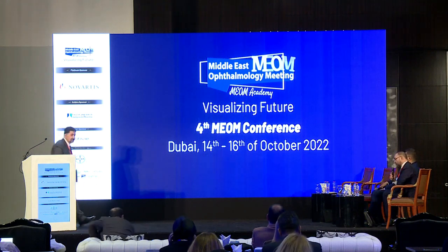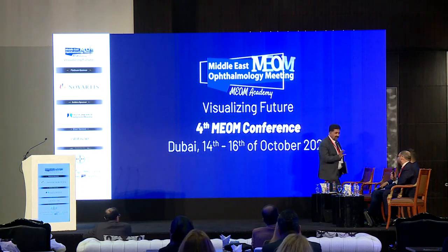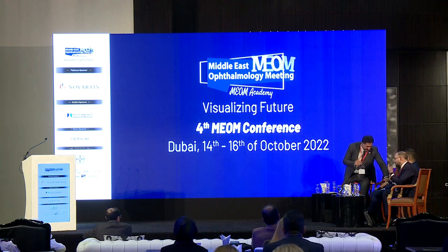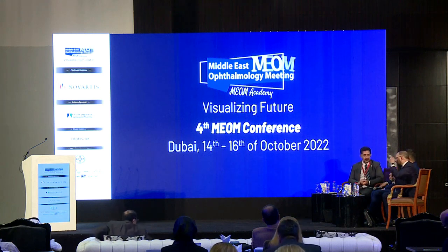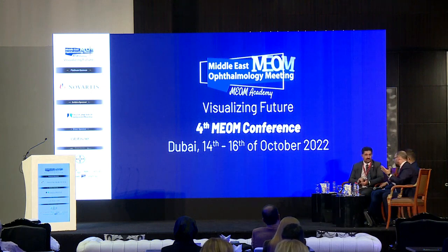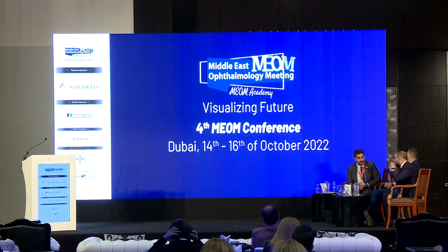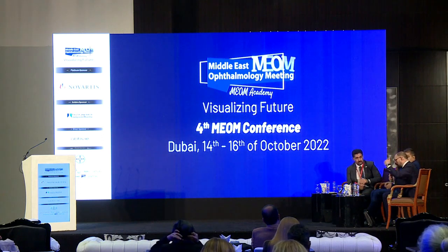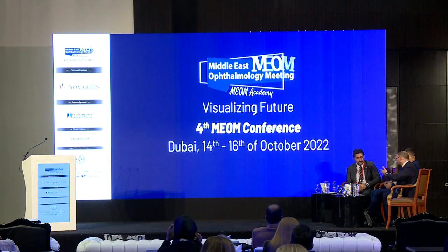Thank you so much. Now we all know that this formula is working, but still, we are always advising the patient that there is no guarantee of 6/6 or an improvement of the vision in an unusual way. There is a high order of patients that we will not cover, and there are a lot of surprises. Now, when we are saying grade 3, we change the residual refractive target from -2 to -3, just to overcome the hyperopic shift. And believe me, we still have a hyperopic shift.